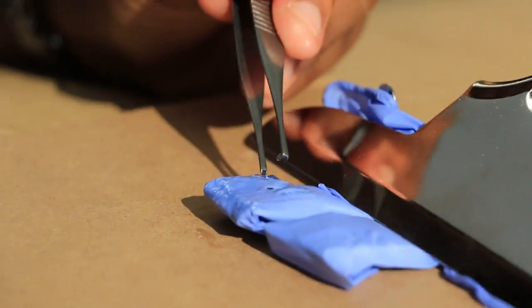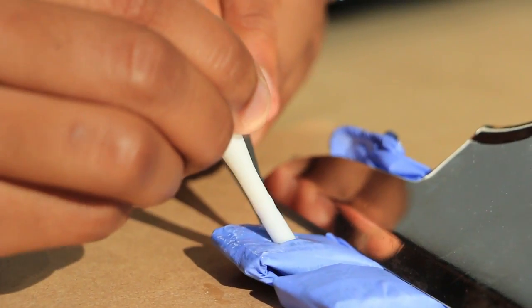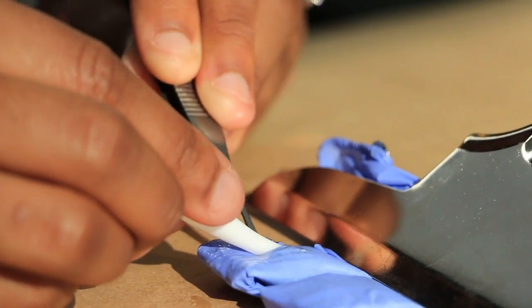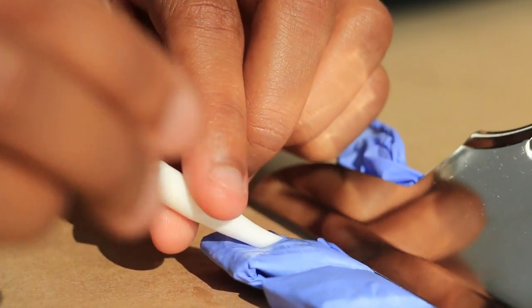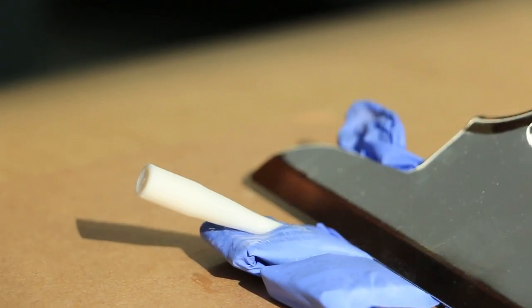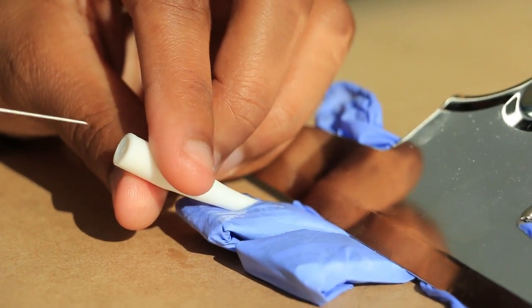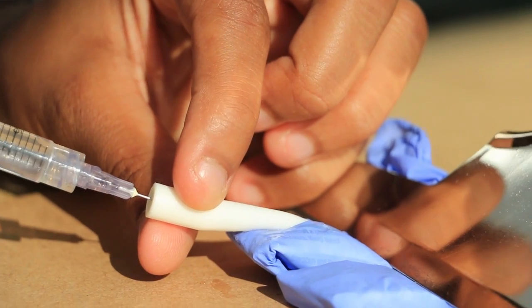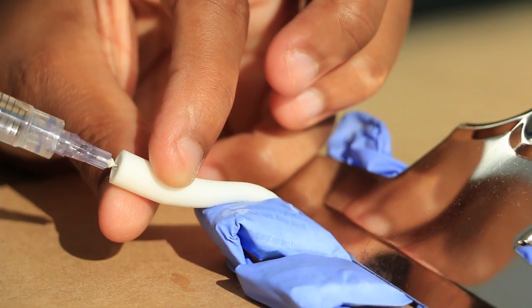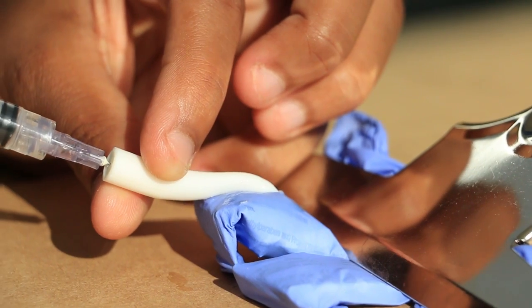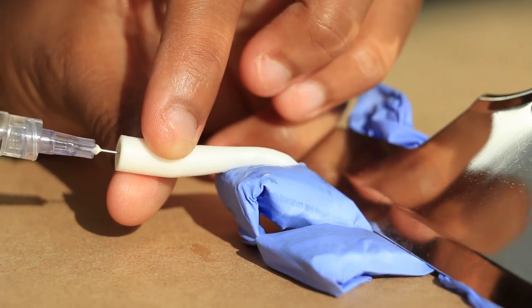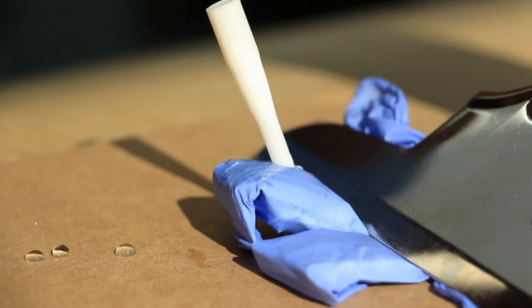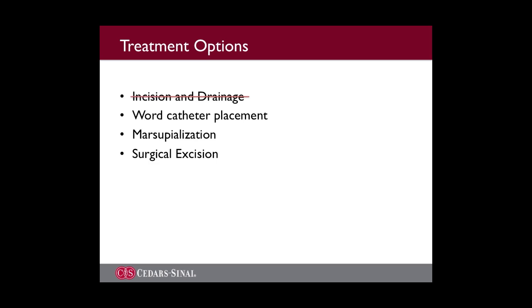After the incision is made, the word catheter is inserted, and the balloon tip is inflated with 2–3 mL of saline solution injected through the hub of the catheter. The inflated balloon allows the catheter to remain within the cavity of the cyst or abscess. The free end of the catheter can be placed in the vagina. If a Bartholin cyst or abscess is too deep, word catheter placement is impractical and other options must be considered.